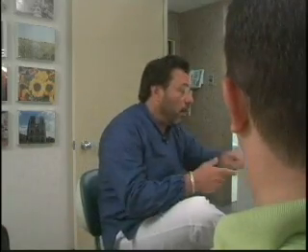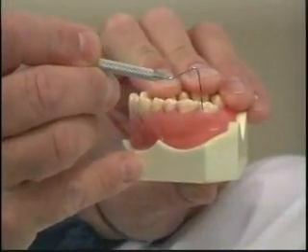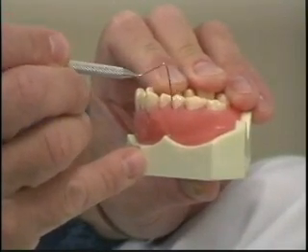They're totally separate. So what you felt me doing was I took my little probe here, which is just a millimeter ruler, and I stuck it in between the gum and the tooth to walk it around and try and find out how far underneath the gum I could get the probe, because that gives me an idea of where the bone level is. Any of the numbers that are 3 or less are fine. Anything over 3 is a problem, which we'll talk about.